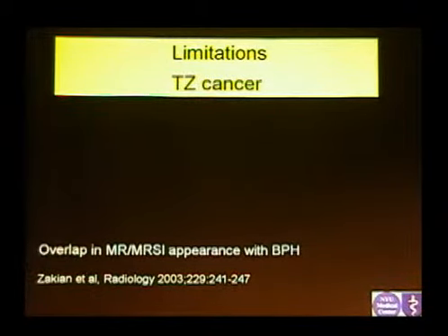Occasionally, patients come from urologists that are stubborn. They don't want to hear my advice. They just keep sending patients a week after the biopsy or 3 days after the biopsy, asking for spectroscopy. I do spectroscopy without big hopes, but sometimes I get some good spectra. But I always tell them at the end that it has to be taken with caution because it's really immediately after the biopsy. Memorial Sloan Kettering, they wait 8 weeks after a biopsy is done to do any imaging.